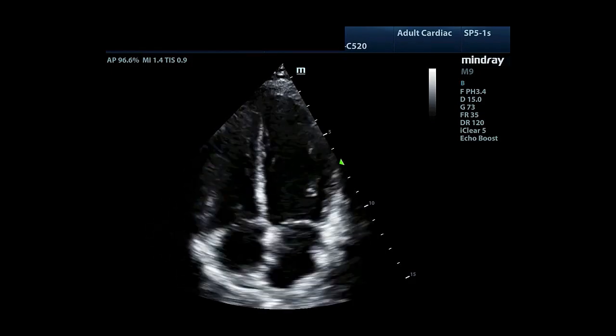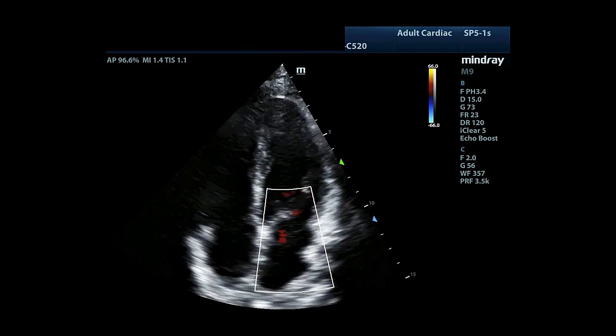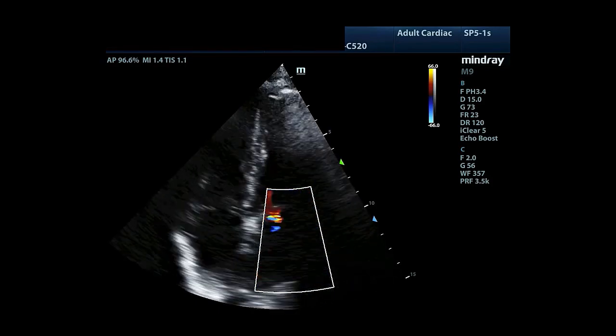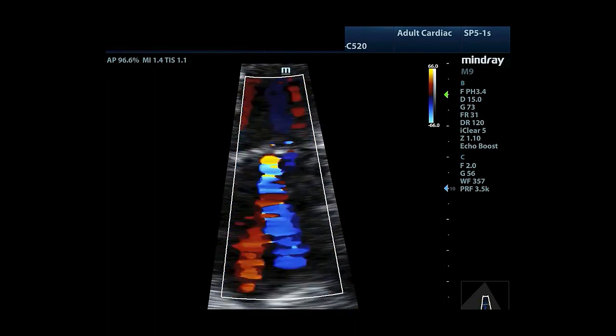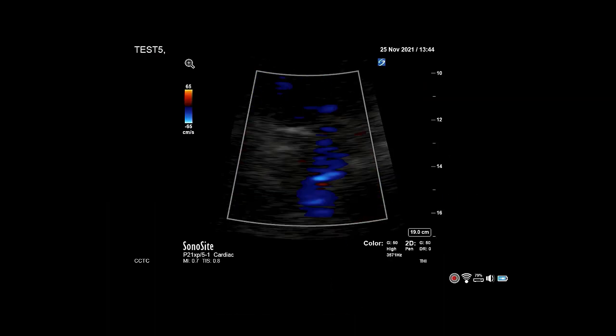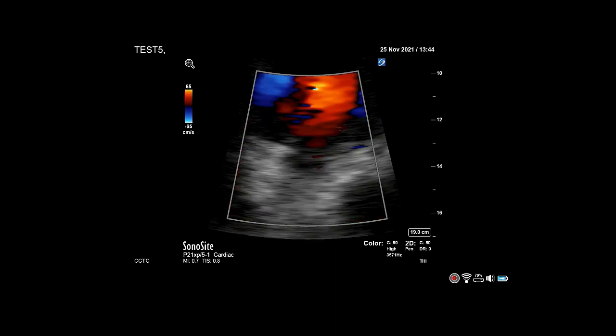To measure vena contracta of mitral regurgitation, start by obtaining an apical 4-chamber view. Put a colour box over the left atria to identify the regurgitant jet. Zoom in on the atria and freeze the image. Now scroll through the frames until you obtain a view that shows flow convergence at the level of the mitral valve.